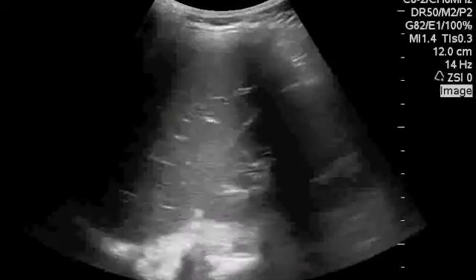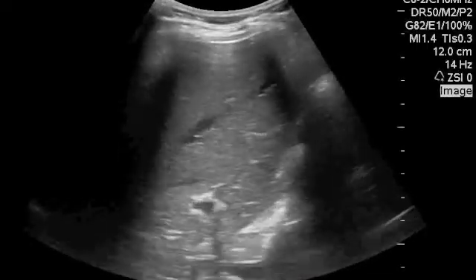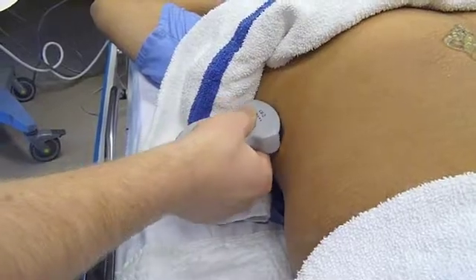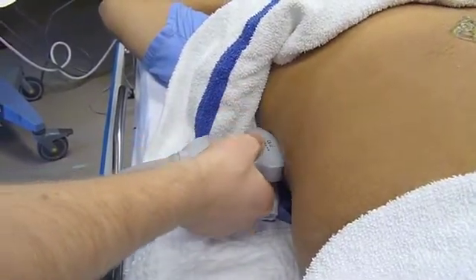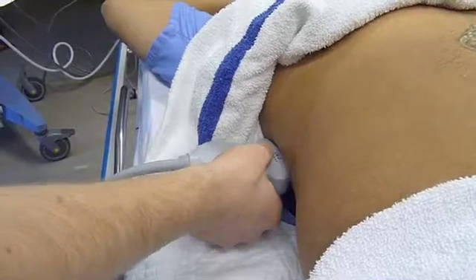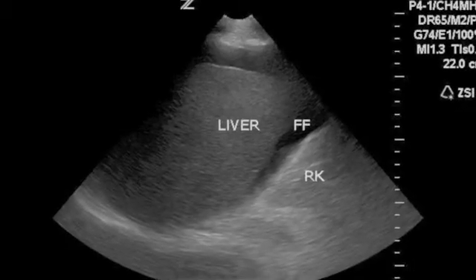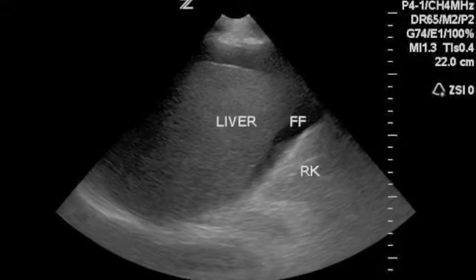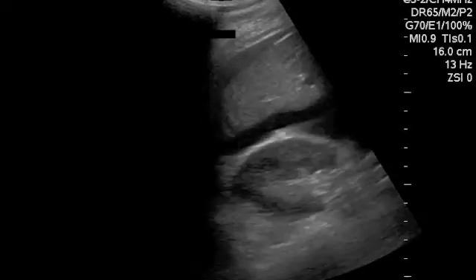Here's what it looks like on the screen — you need to see the kidney disappear in both directions. Don't sweep like this: here I'm not keeping my contact point constant. I call this 'painting' because it looks like I'm painting a fence with the probe. Here you can see free fluid in the right upper quadrant along the interface between the liver and the kidney. Here's a video of the same thing.